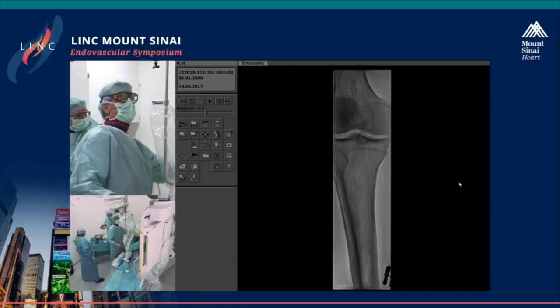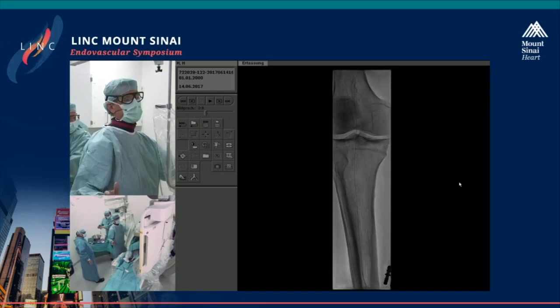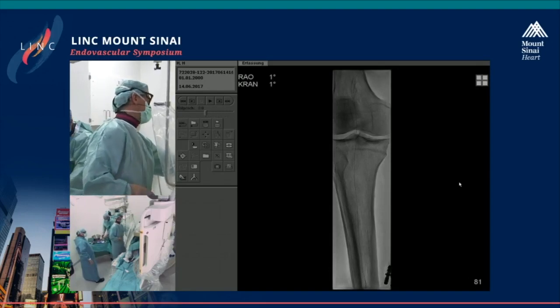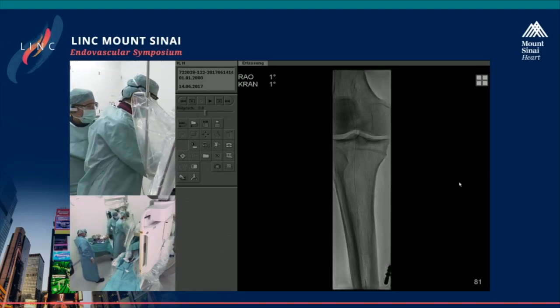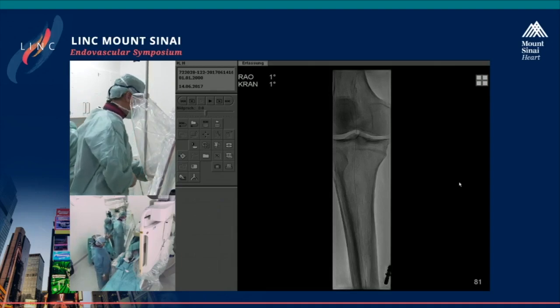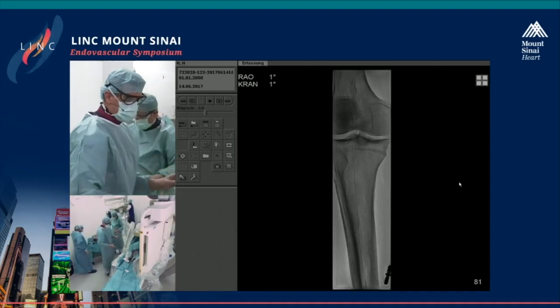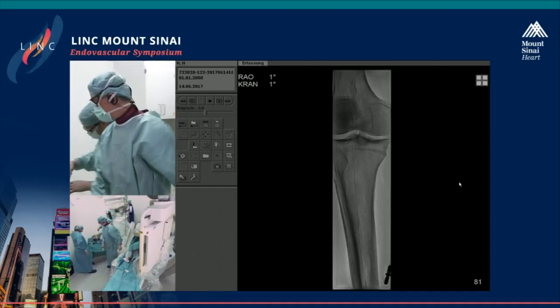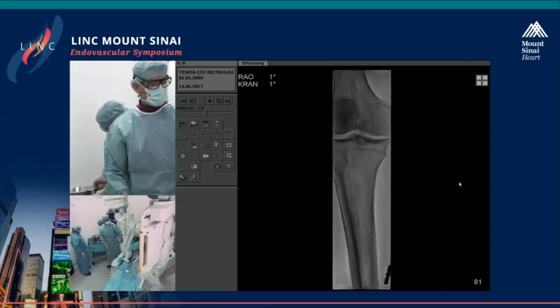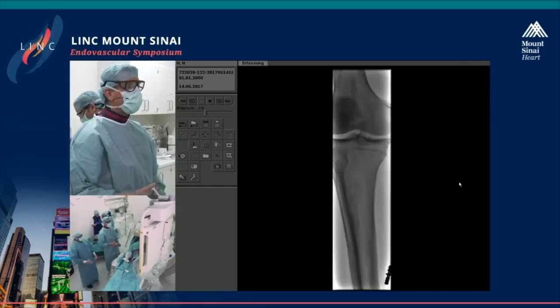Pressure down. The last injections were, let's say, partially effective, maybe due to calcification. Now we take the blood pressure down. I'm not sure about the result. I'm afraid that we also had maybe a little bit of thrombus in that lesion. Let's see. Nitro again. Do we need nitro again? Okay. So I wait until the pressure of the blood pressure cuff is completely down, and now I'll give you an injection. Hopefully we have some flow.